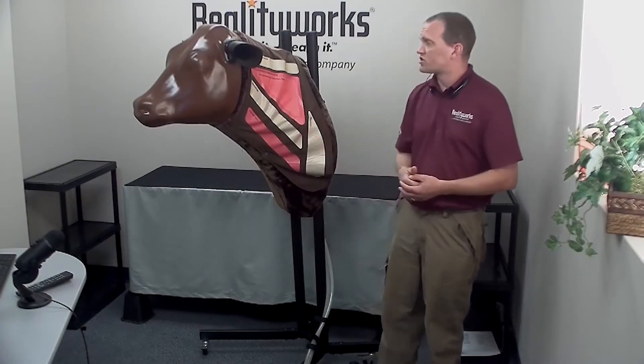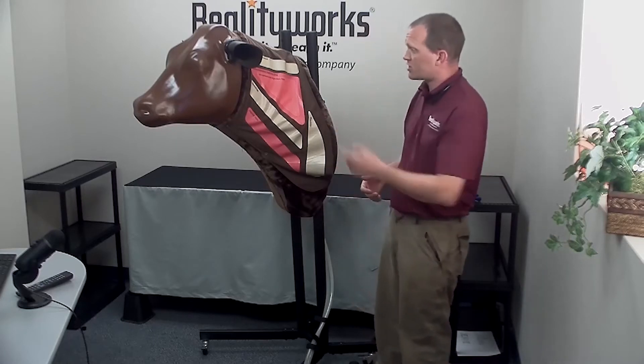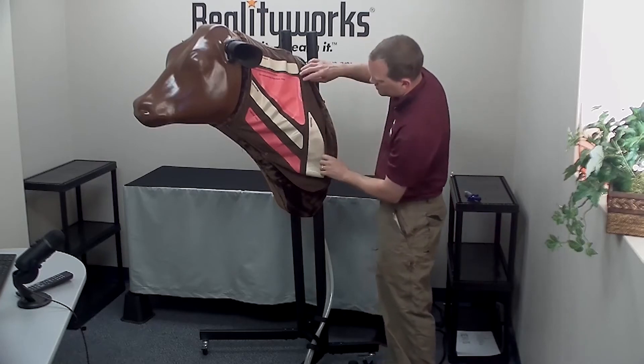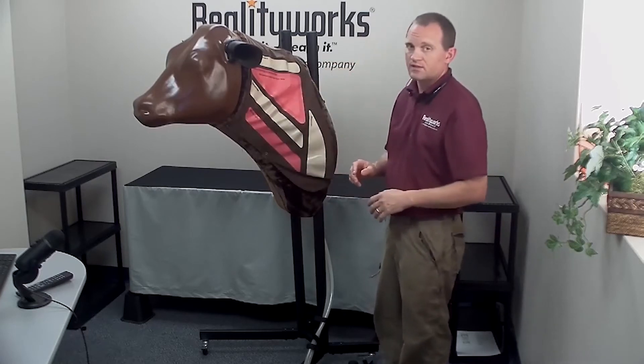Hello, this is the bovine injection simulator. In this video we are going to show you where to inject and draw fluid from the bovine injection simulator. First of all, look at the little covering right here where it shows you the areas that you will be injecting the needle.